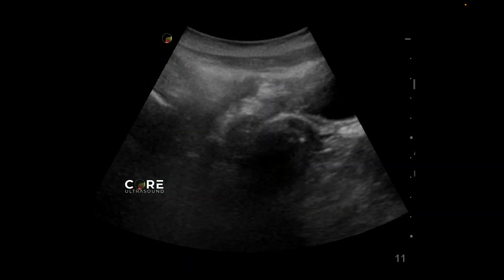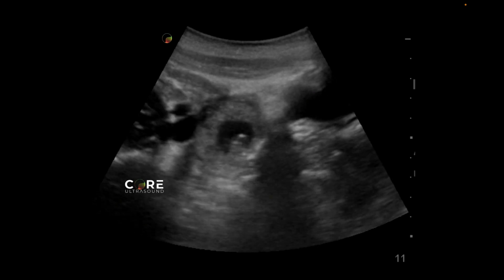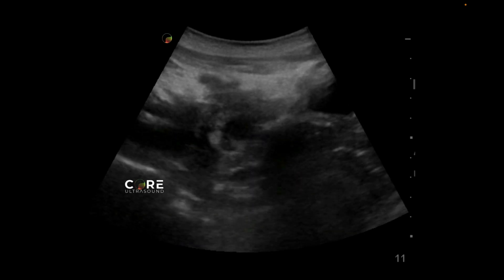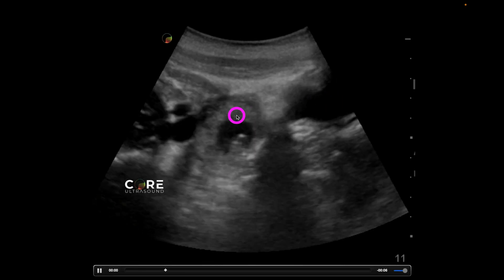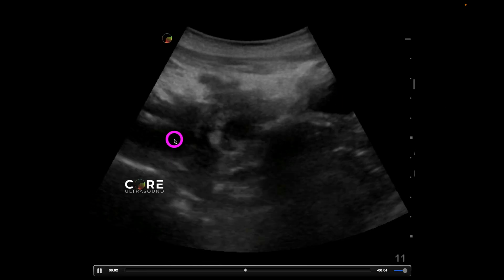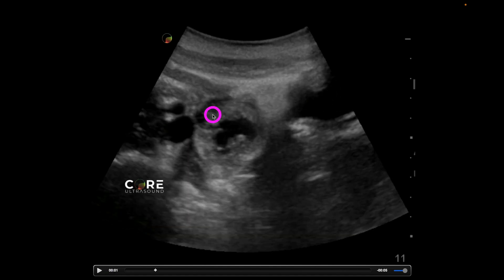Besides looking at the thickness of the myometrium, you can simply look for a gestational sac not in the location it should be. Over here we're seeing the bladder; I don't really see any uterus whatsoever. We're actually seeing the iliac vessels right here, and we're seeing this gestational sac just hanging out all by itself outside of the uterus, right next to those iliac vessels. This is an ectopic pregnancy.